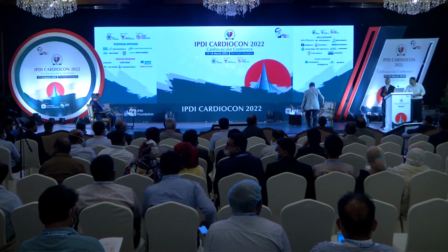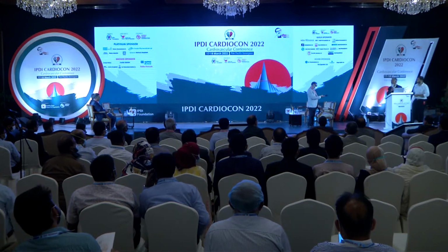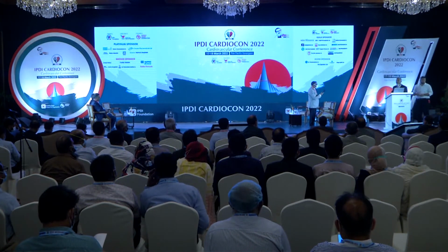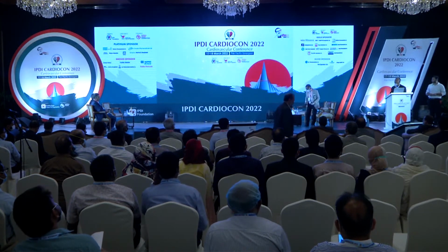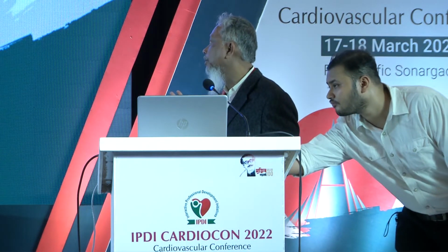Sure. Can you tell me the practical points of measuring the RV function in day-to-day echocardiography? Sir, TAPSE and right ventricular fractional shortening are important, but in my presentation, I have shown the measurement of the pulmonary pressure, as well as the ratio of TAPSE and the systolic pulmonary pressure, which really indicates the real RV function. In day-to-day life, TAPSE is the most important measure, but we have to keep in mind TAPSE does not always represent the true RV function, as we have seen in my 2 cases.